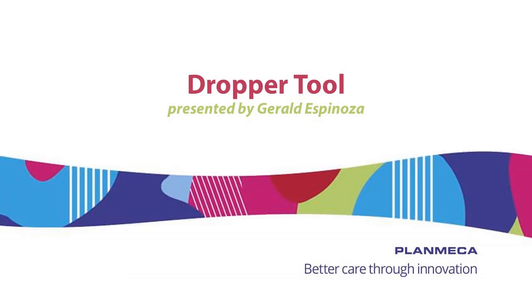Hello, my name is Gerald Espinoza, Clinical Specialist for PlanMECA USA. The topic for today's video is dropper tool.